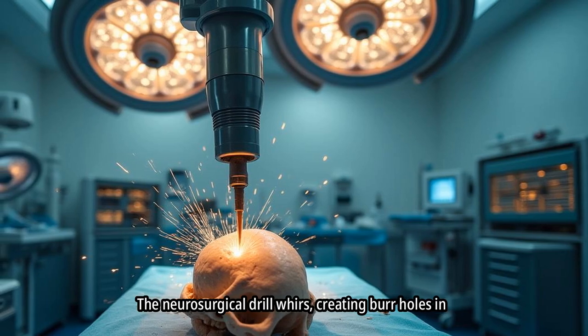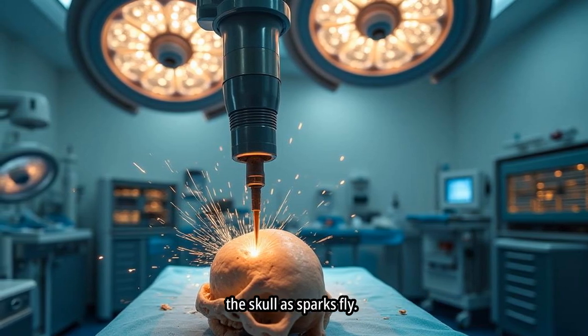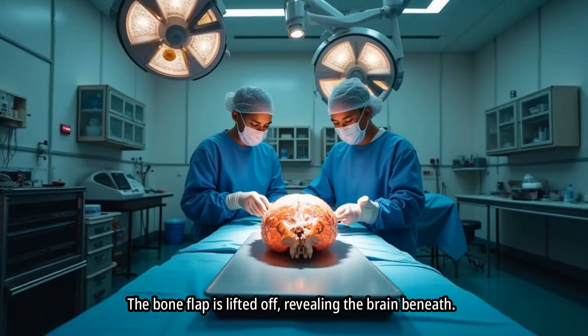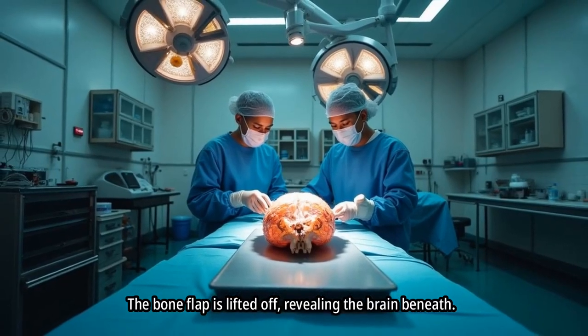The neurosurgical drill whirs, creating burr holes in the skull as sparks fly. The craniotomy cuts between the burr holes, the blade humming. The bone flap is lifted off, revealing the brain beneath.